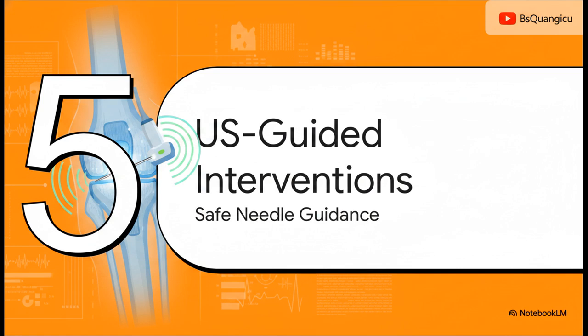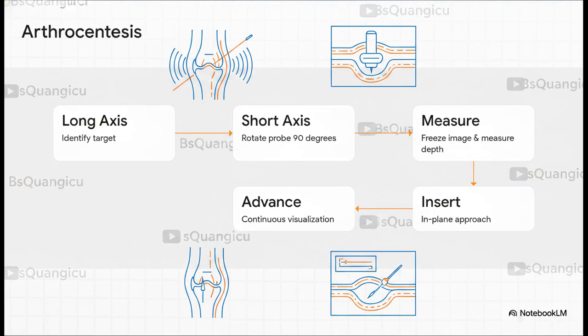Section 5, Ultrasound-Guided Knee Interventions. Safe needle guidance. Whether you're draining an effusion with arthrocentesis or injecting some therapeutic medication, ultrasound guidance is absolutely the gold standard. And the workflow is really elegant.